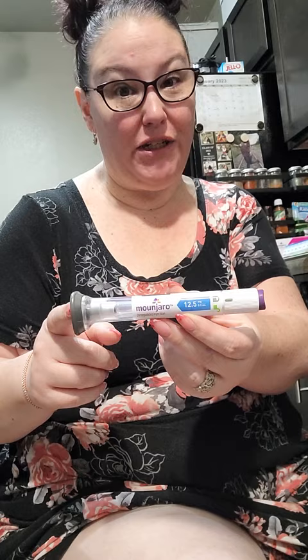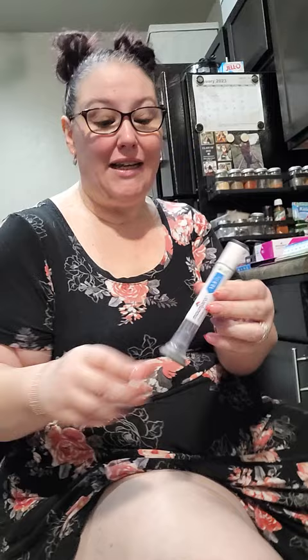First up, sanitize! While I'm letting that dry I'll explain the pen to you really quick. It's a gray cap we're not gonna remove till we're ready to inject. There's a collar that twists to the green unlock position and the purple button that dispenses the meds. So we're just gonna remove the cap, press firmly, rotate the collar, and push to inject.